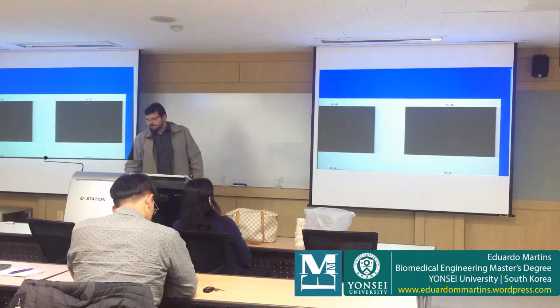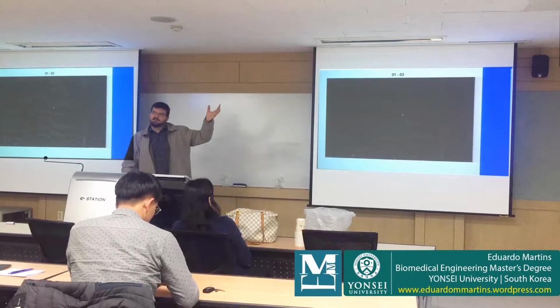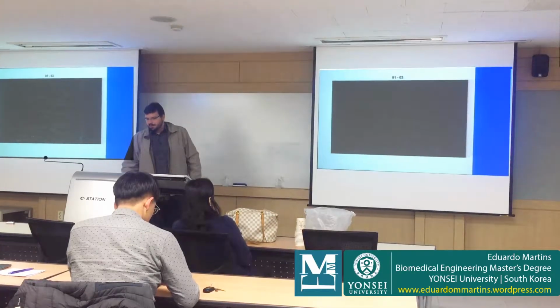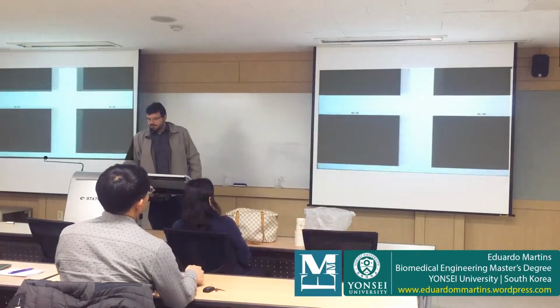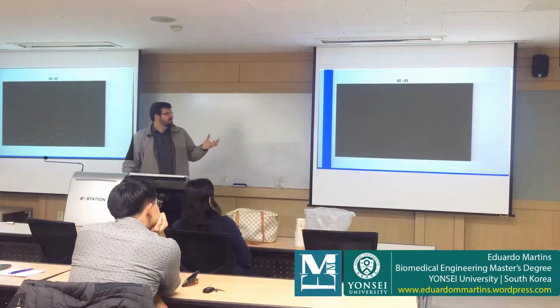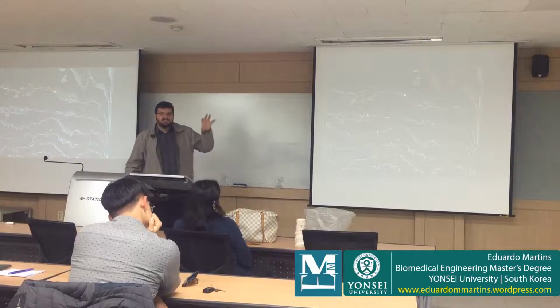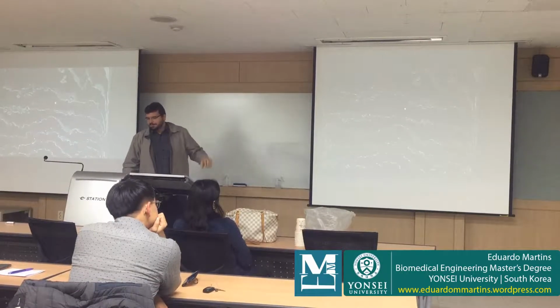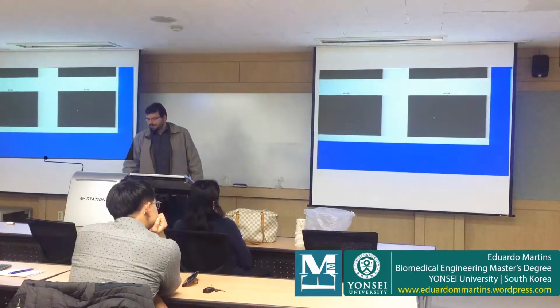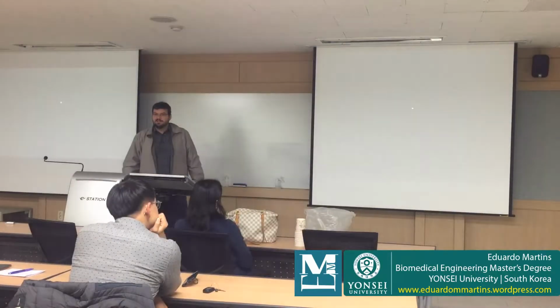Here, it's 0_1 minus 0_3, for example index minus ring, just to check if there is a difference. And here, this is 2 minus 3, and there is a difference too. As a test, you can see here, here's better. All these lines are the difference between the images, the different parts. And here, it's all black because it's the same image minus the same image. So it's black, so there is no difference.